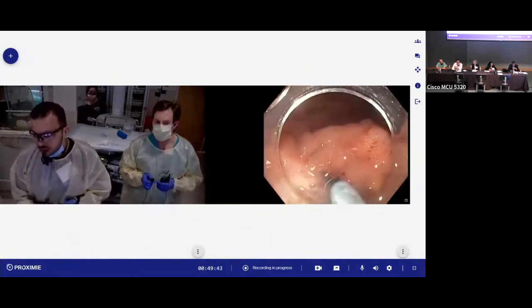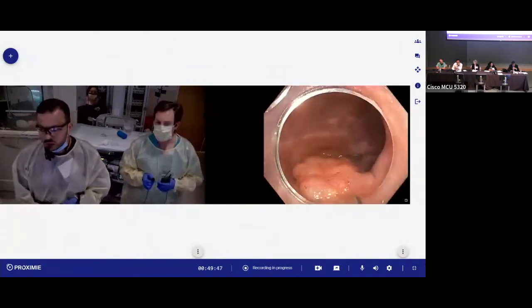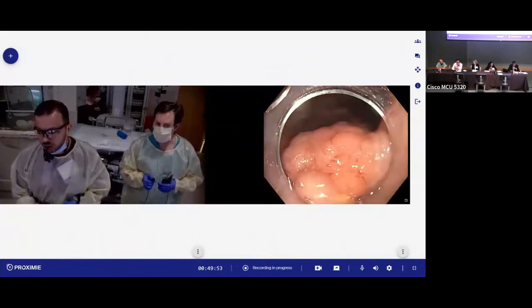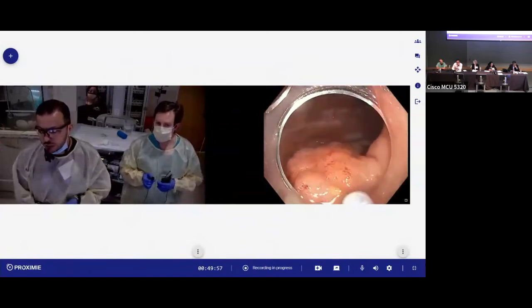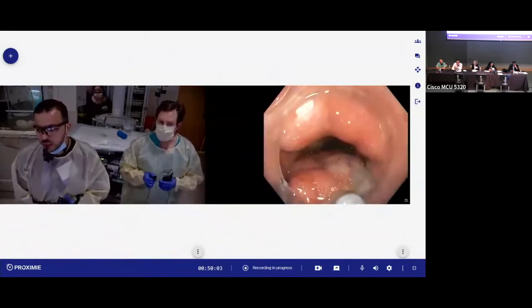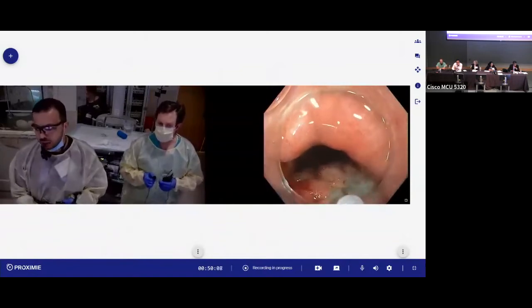Hazem, can you talk to us a little bit about your technique to perform submucosal lifts? Sure. So I have the needle here. Some people put the needle deep into the tissue and pull back. I just get inside the submucosal space and inject. And then what I do is I suction, I pull back, I go up and suction the lumen, inject, hard and fast, stop, needle back.